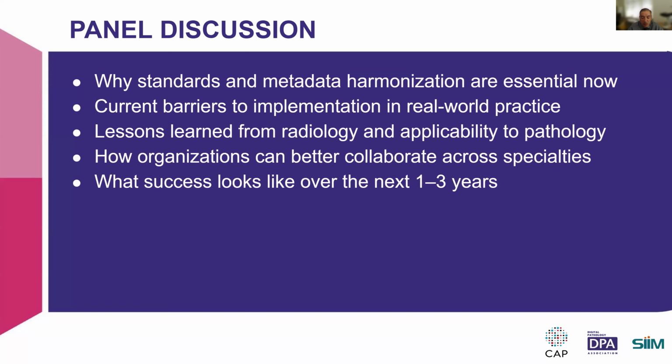I think digital pathology standards are maturing to the point where it's the right time for vendors to invest their time, effort and resources to accelerate the accessibility of their products in an interoperable digital pathology ecosystem. For those of you that are not vendors on the call, but have decision-making power within your organization, you need to express that the vendors that you bring on board support digital pathology standards, and you have to dig a little deeper than simply asking, do you support DICOM? You have to ask, in what ways are you supporting that standard?